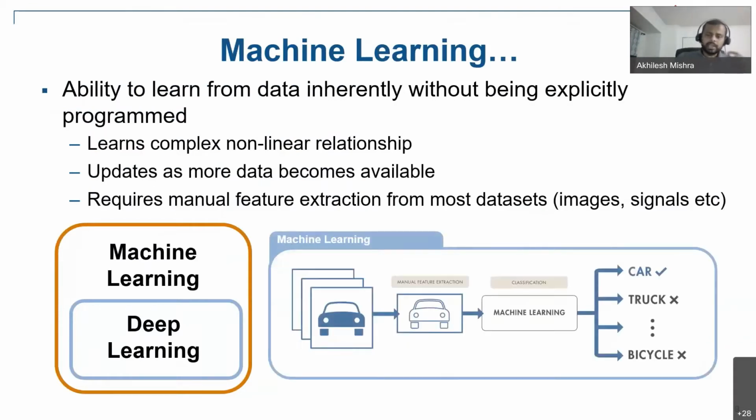But another thing I would point out over here is, in machine learning, there's always a feature extraction step. And for a real world scenario, this step can be quintessential for making the algorithm work, but there are some pros and cons to that approach. The biggest pro being that if you do that manual feature extraction step from your data, then you can actually train some simpler models, which are easier to get verified and validated by a certification authority like the FDA.